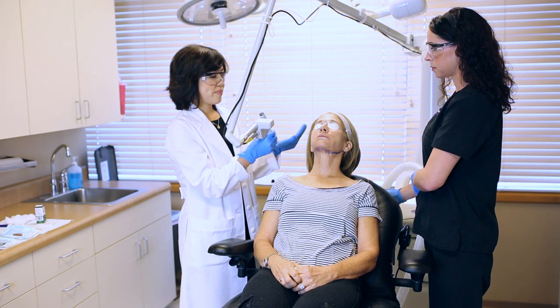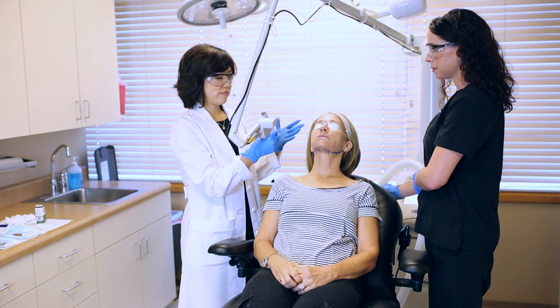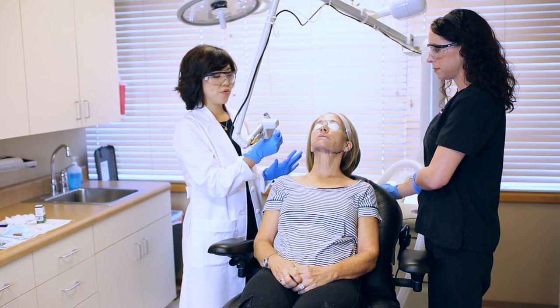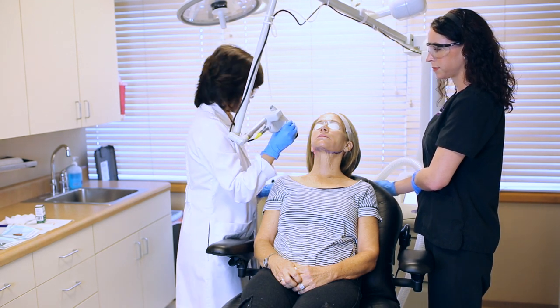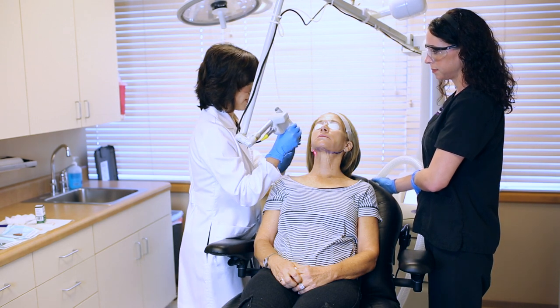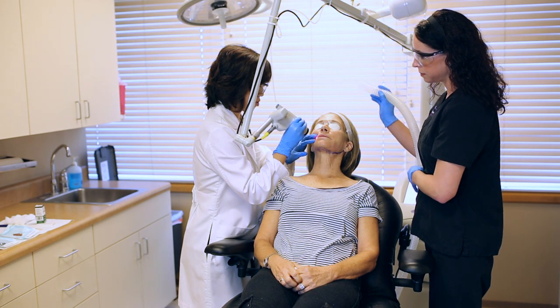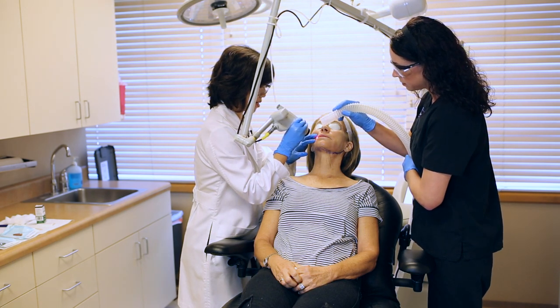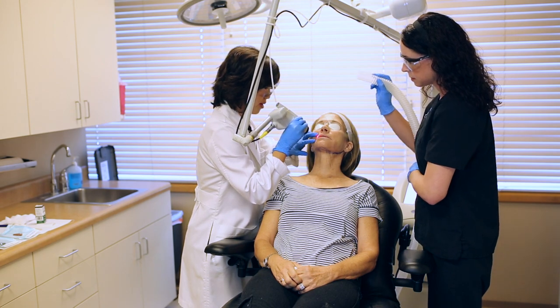The patient has been numbed, so she should feel pretty comfortable through the procedure. We're going to get started and begin with her problem area, which was really around the mouth. So we're going to do a little bit of laser here. Let's just do one test spot and see how she tolerates it. How was that? Fine. Okay. Here we go.